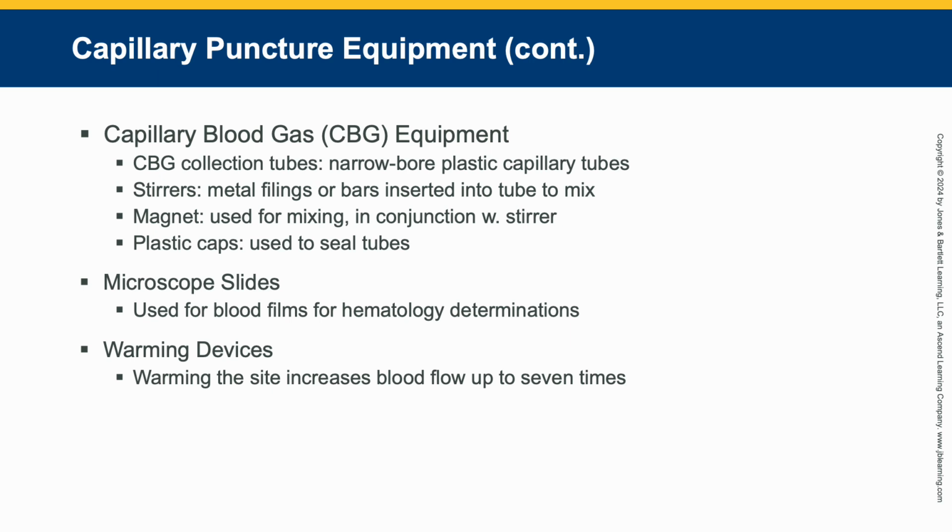You just want to make sure, if you're using water and not a commercially made heel warmer, that you don't get the water so hot that it scalds the person. But basically what this does is increase the blood flow up to 7 times, which makes their blood come out a lot better for you when you're trying to collect it.